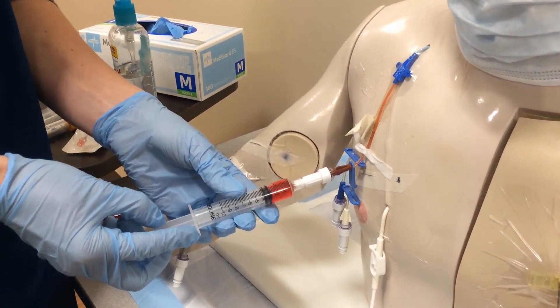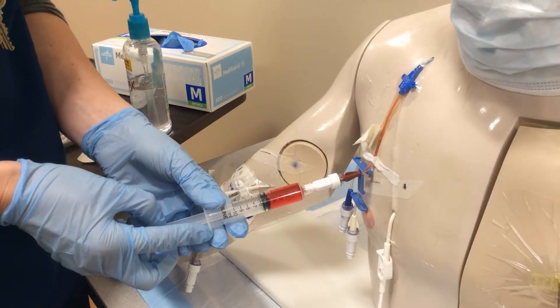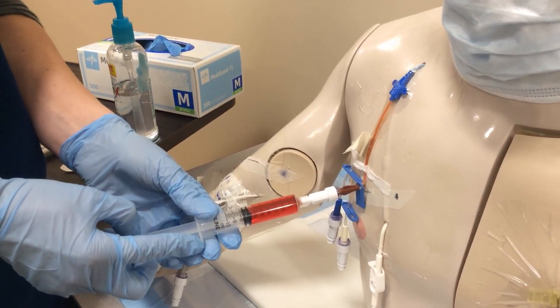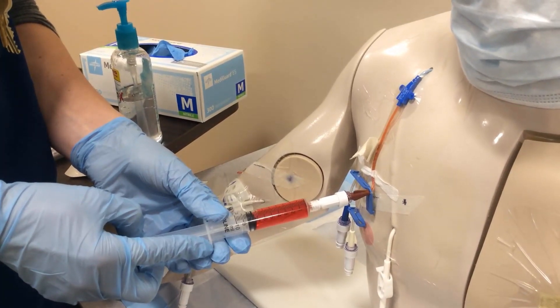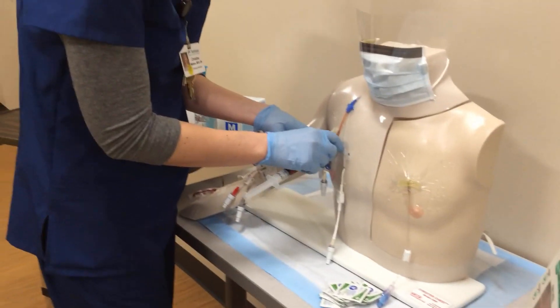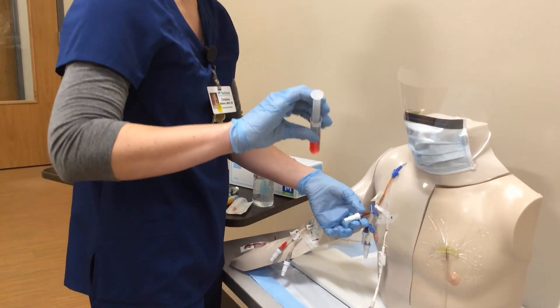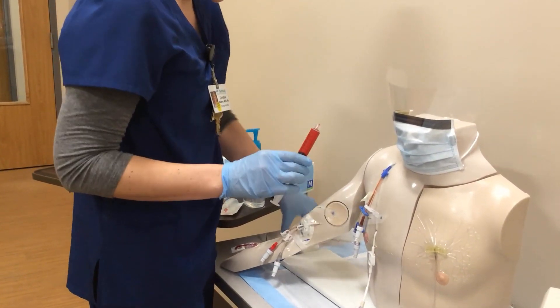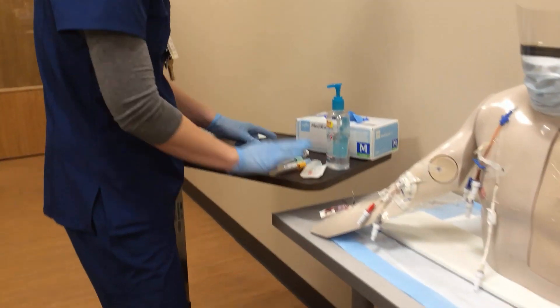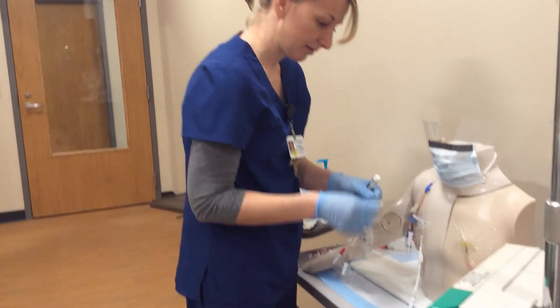I've hooked my syringe on there. I'm going to open up the clamp and draw back nice and slowly so I don't hemolyze the blood — however much blood I need to fill the physician's orders. He's only put orders for a couple of things. Lab tells me 8ml is plenty. Before I disconnect that syringe I want to clamp the line again, then disconnect and invert the syringe a few times. I'll set it in an empty container until I'm ready to transfer it to the appropriate tube.